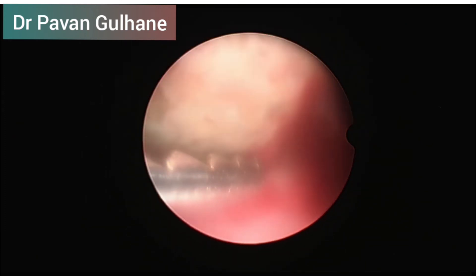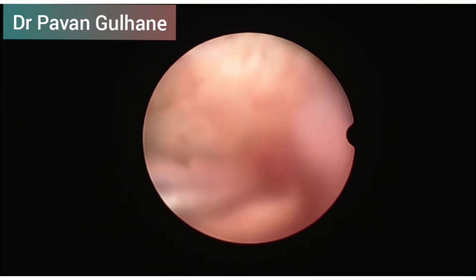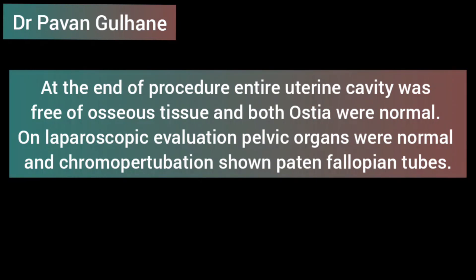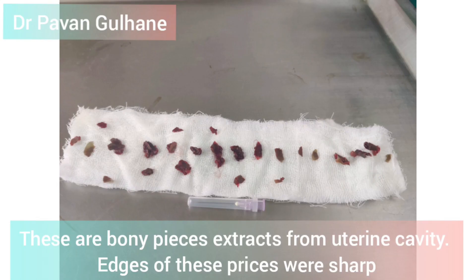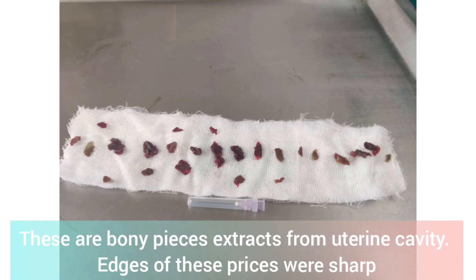Post hysteroscopy we can give estrogen therapy to the patient for normal healing of the endometrium. At the end of the procedure the entire uterine cavity was free of osseous tissue and both ostia were normal. Laparoscopic evaluation was suggestive of bilateral patent fallopian tubes and normal pelvic organs. You can notice the number of bony pieces taken out of the uterus. Two months after the procedure, the patient conceived and delivered a healthy child after 9 months.